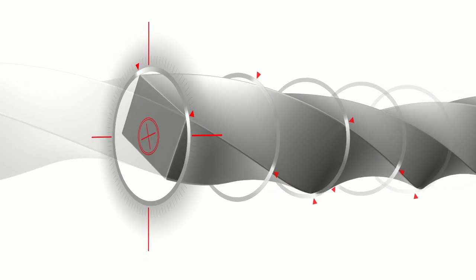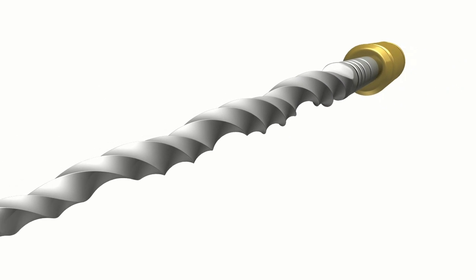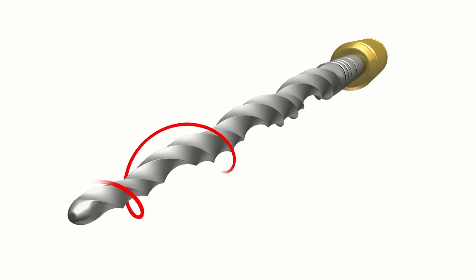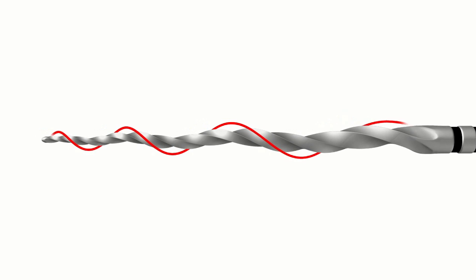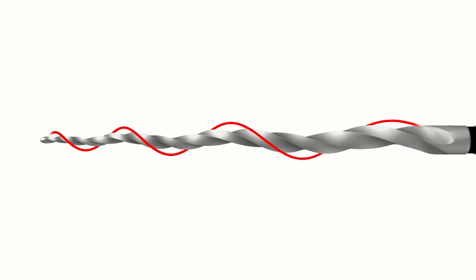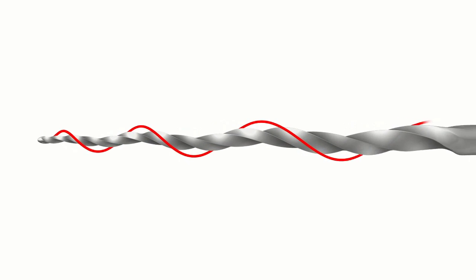As we pull away from the file, something extraordinary begins to reveal itself. Here you can see another aspect of the unique design of the ProTaper Next instruments. Next provides an asymmetrical rotary motion. Follow the red sine wave to see where the file is contacting the canal walls and, just as importantly, where the file is not contacting the canal walls.